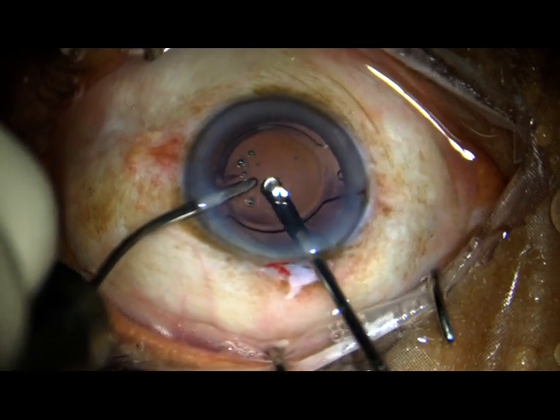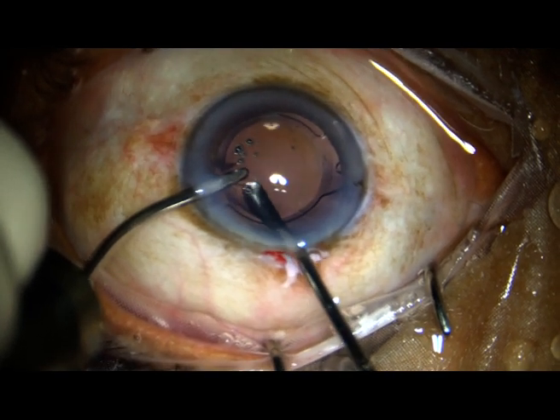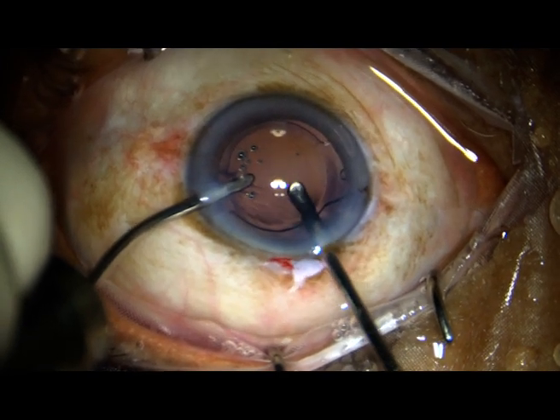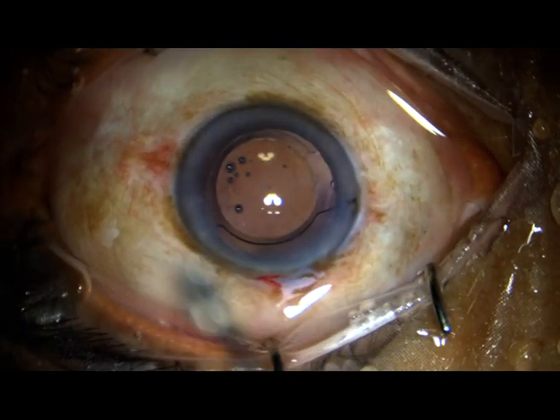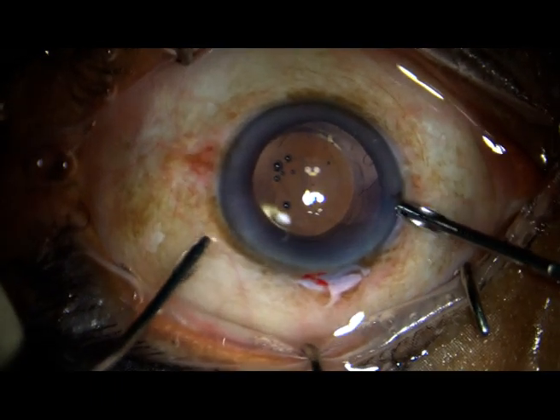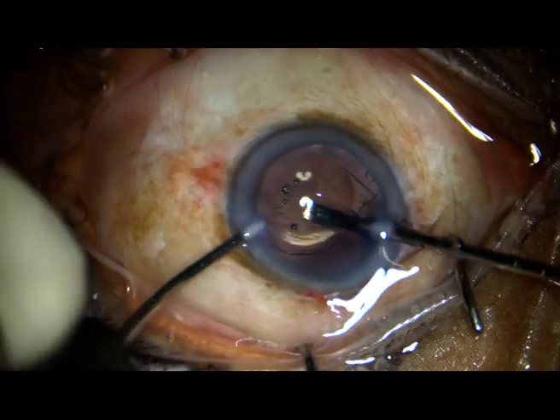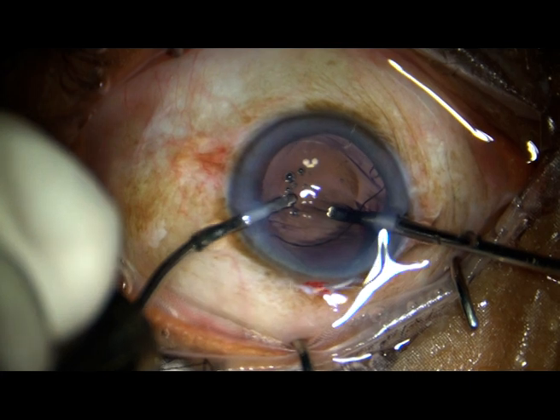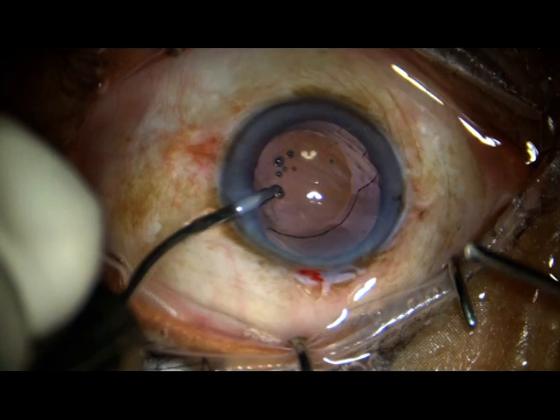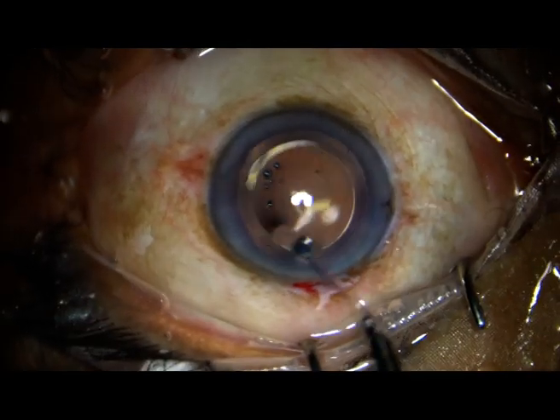Dear colleagues, we must do adequate anterior vitrectomy, giving quality time to the patient. We must not hurry to complete the anterior vitrectomy somehow. The lens is nicely placed in the sulcus and it is very stable.